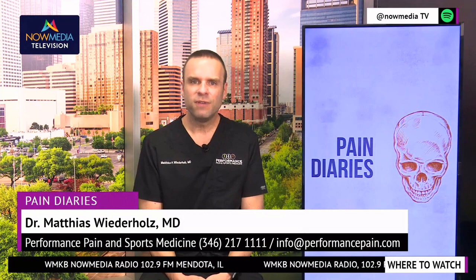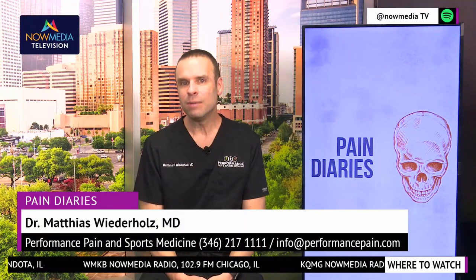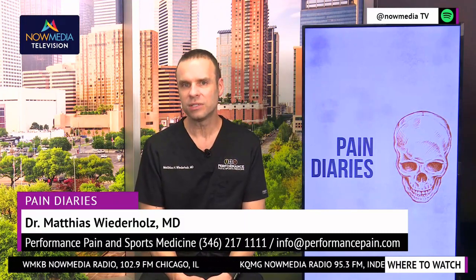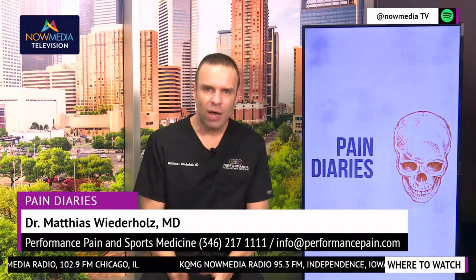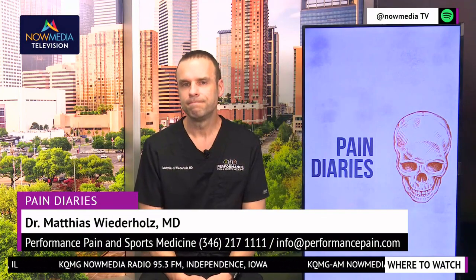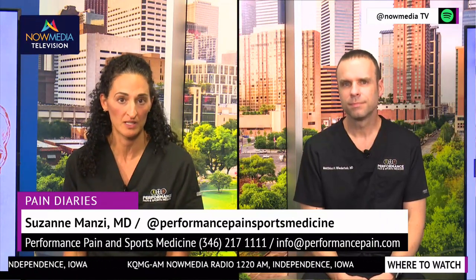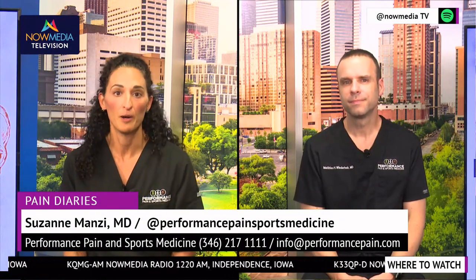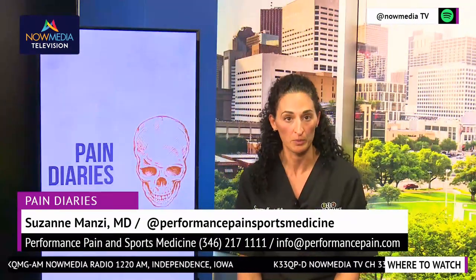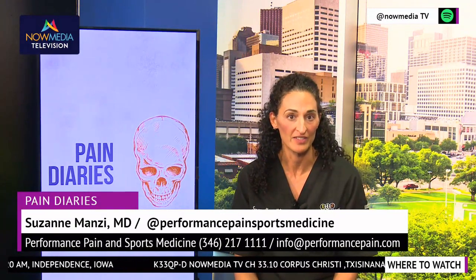It used to be about 50-50 as far as who gets a paddle and who gets a percutaneous electrode array. In our practice, as you know, it's about 99% of patients who get percutaneous electrodes because of how less invasive the surgery is and how reversible this procedure is. No, absolutely. I know patients really do prefer the percutaneous leads, especially in the mid-back where the leads are put in when it's for the low back and leg pain, because it seems to be a less painful option. And easier recovery as well. That's always key. People want to get back to living their lives as fast as they possibly can.